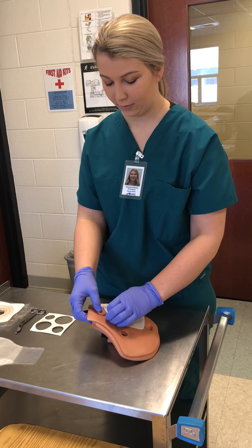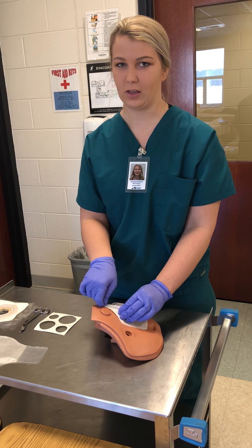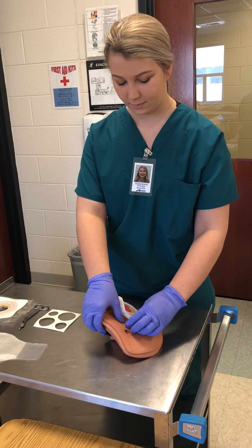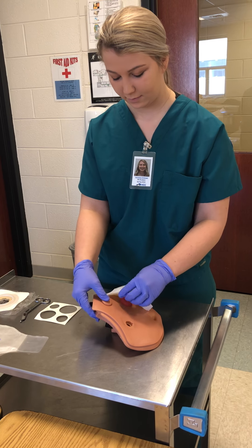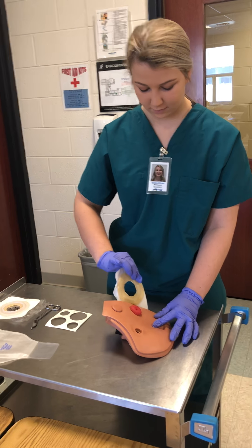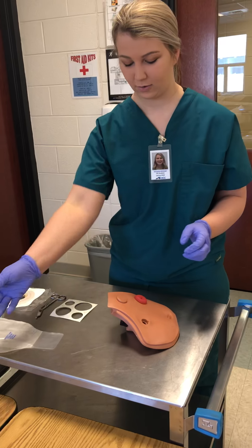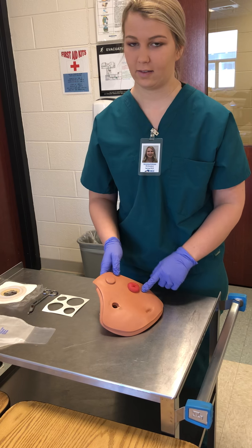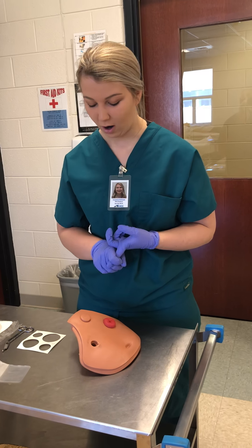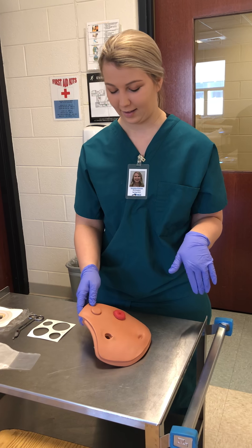Now I'm going to remove the wafer, and if they have fragile skin then I can use alcohol to kind of make it easier. I'm going to assess the stoma and assess the color. This one is a good red color. I would be noting if it's necrotic, if there's any color changes, if anything's abnormal.